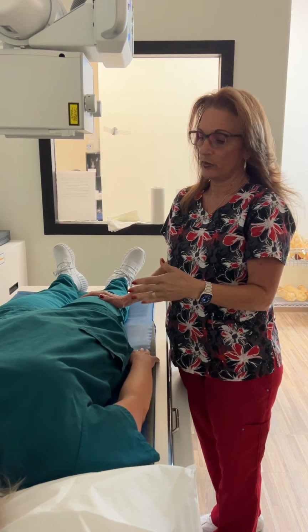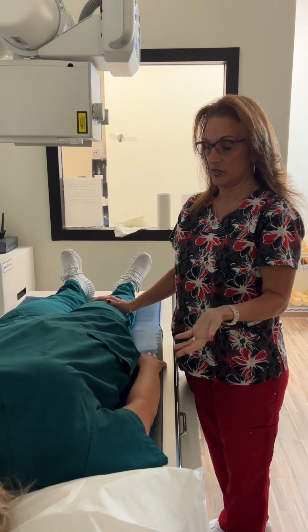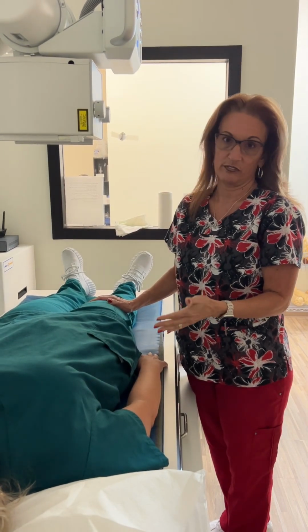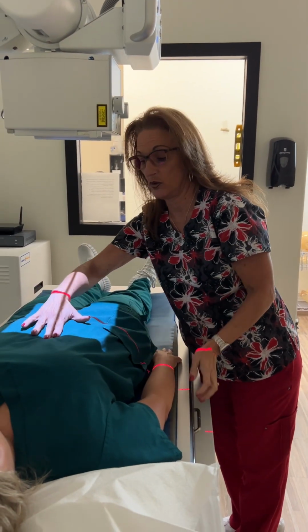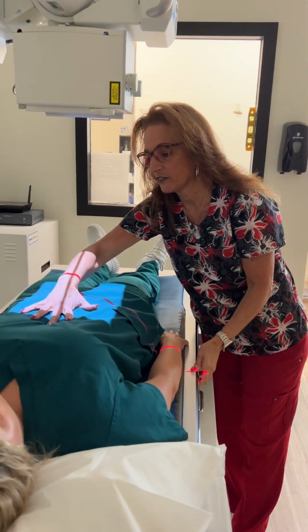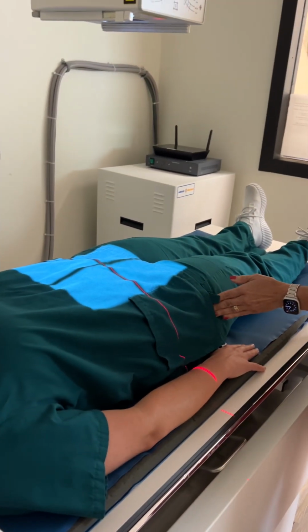So what we're going to do does go against ARRT and against what the registry teaches, because a supine abdomen does not show air fluid levels, but we are gonna do what's expected, even though when we take the registry, we know that that is not the case, that we need diaphragm on this image. So our first image is gonna be the bottom image to capture pubic symphysis.